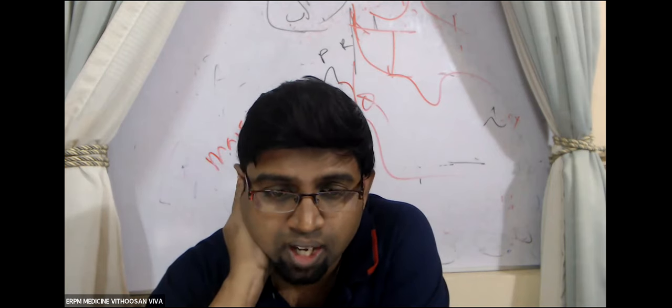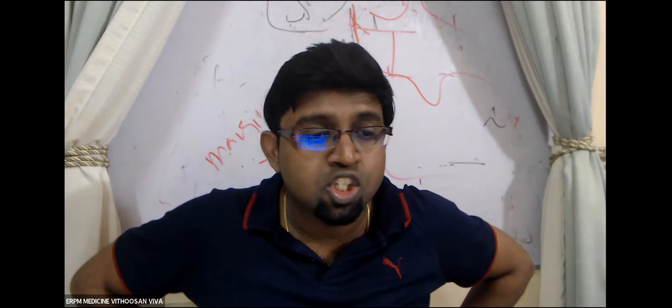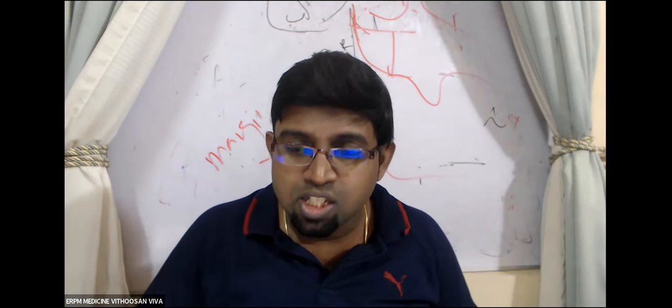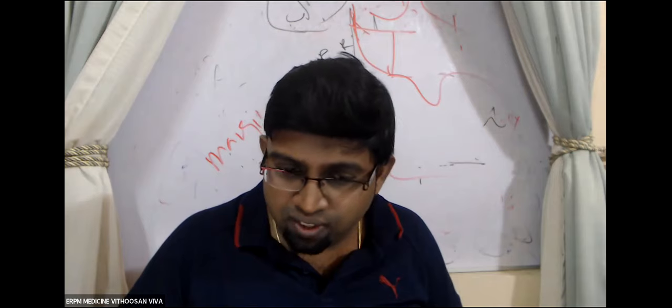So they can have a right ventricular MI as well, no? Yes or no? Now look at me. What is the point we studied earlier? The normal ECG is not looking at the posterior and right side of the heart. The normal ECG is not looking at the right ventricle.